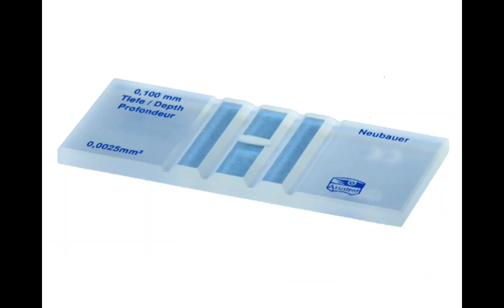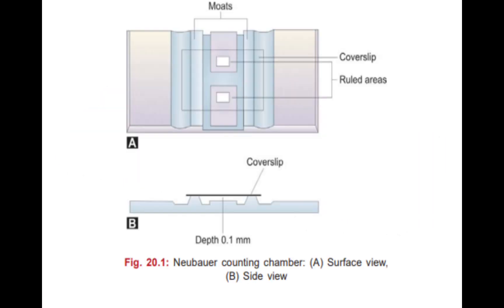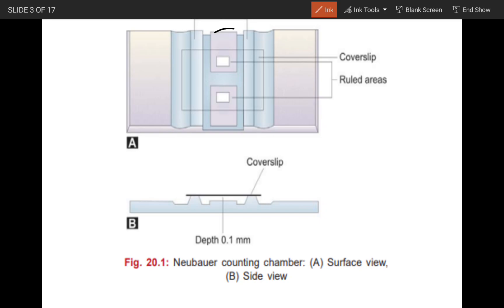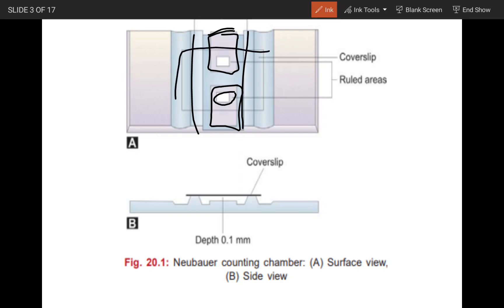This is your Neubauer chamber. This is used for calculation of cells, whether it is TLC or for your fluid examination. We have two moats or wells, and these are the counting areas — two big areas with counter-ruled areas on which we count. A cover slip is placed over it; a specialized, very thick cover slip comes for it, especially just for this counting purpose, to give the exact volume needed and to show the exact distribution of the cells.